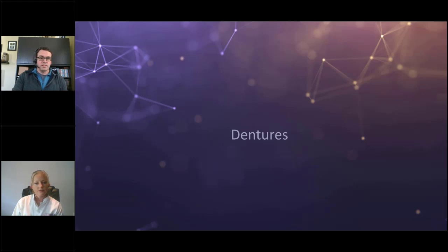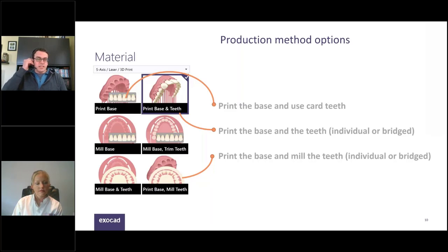Next up, we'll take a look at dentures. So a new feature in the latest Exocad release, when you go into DB and set up a case, we have 6 different manufacturing process combinations set up in here. So here we have 3 highlighted that involve 3D printing.